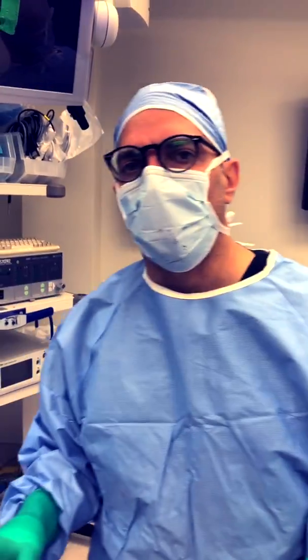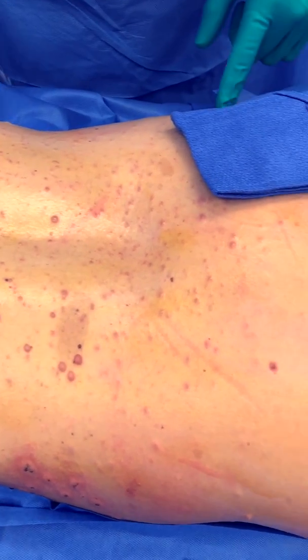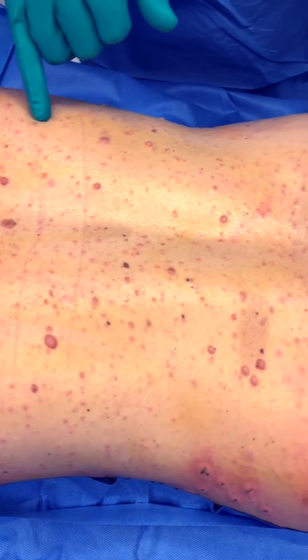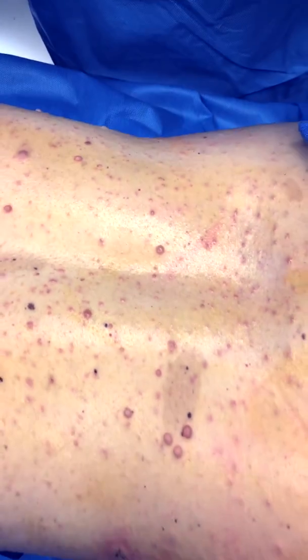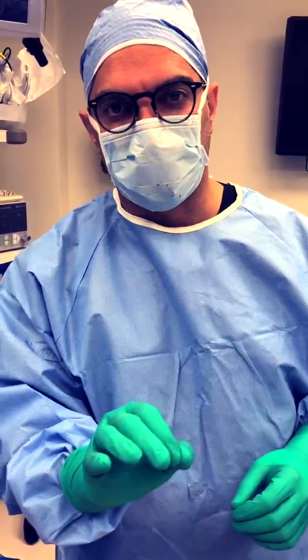We have another patient here with neurofibromatosis and we're doing electro desiccation. We did the front side, and I usually don't go to the back side, but in certain mild cases such as this — she's got a relatively mild case with some semi-large bumps and mostly tiny tiny specks. Getting this done early is actually a good thing; we want to catch these bumps when they're small.